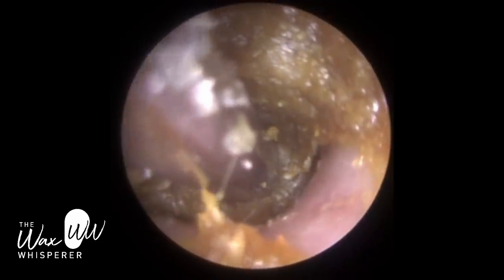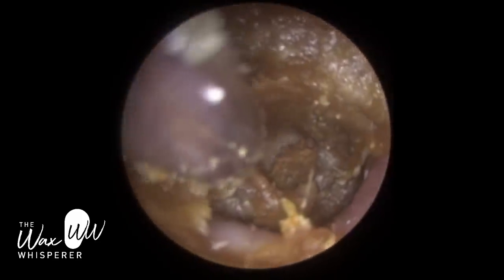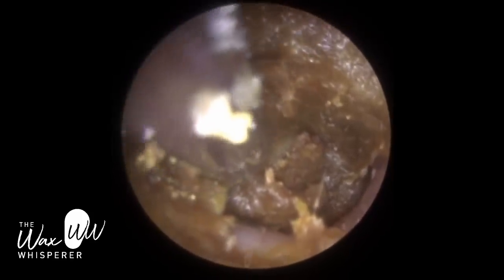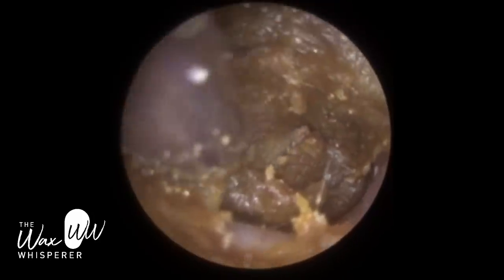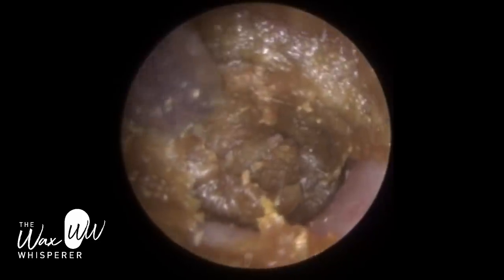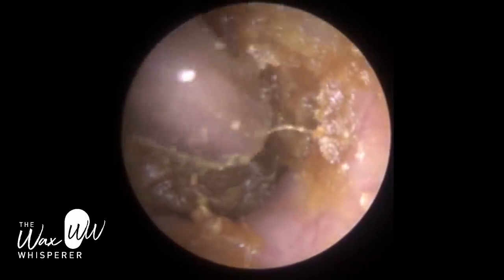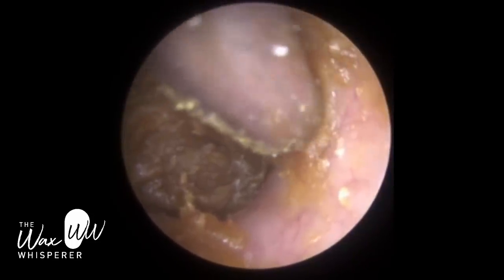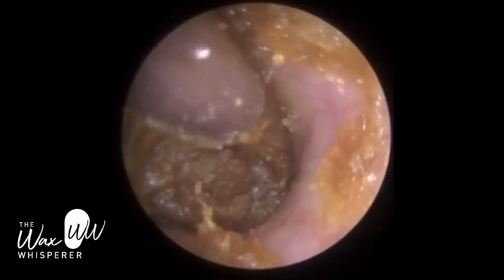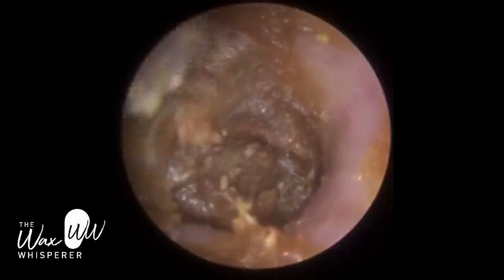In a moment you'll see me quickly skirt around the edge. This wax, because of its consistency, is very hard to get a suction grip on. You can see the Zolnir suction probe has actually imprinted a mark within the soft wax. The patient had been using drops already on this side, but you'll see in a moment I will put some drops in. I was just mopping up around the edge, but this peel of the canal wall stops here and isn't going to help me remove the main body of wax — and that's actually a good illustration.